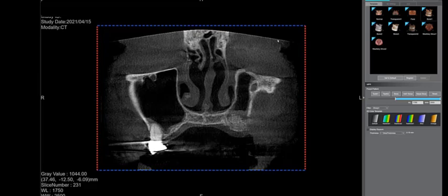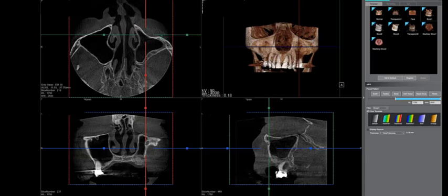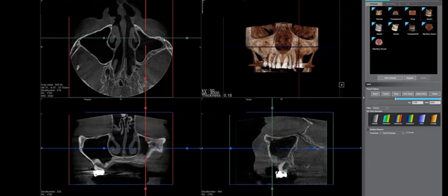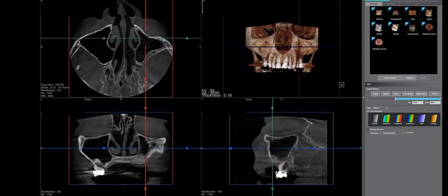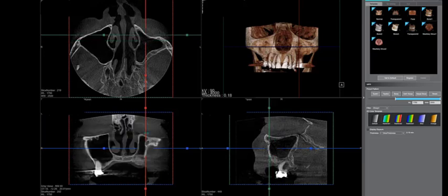Which was kind of interesting because we always pre-medicate with antibiotics. Anyway, I won't go into the whole protocol that we use, but it was nice to be able to take the CT scan and kind of see the extent of what was going on in her sinus. So you can kind of compare this sinus to that one that we were just looking at. But I was able to see that it didn't occlude the entire sinus. I could get a gauge for where she was at, and then prescribe some different antibiotics and put her on a regimen to help things settle down.